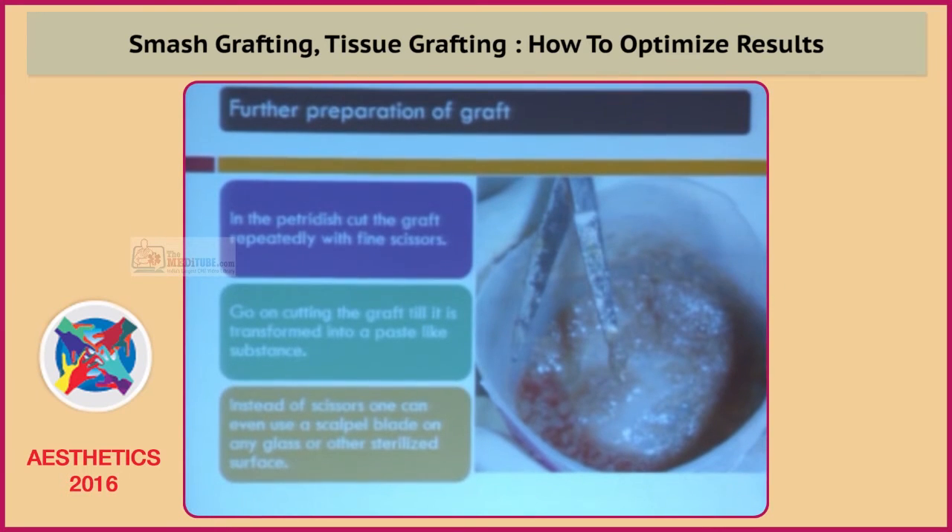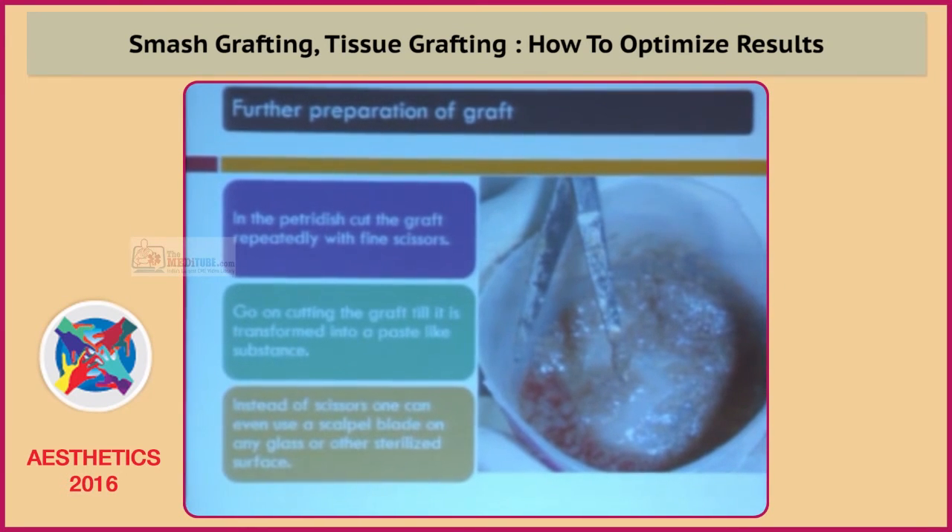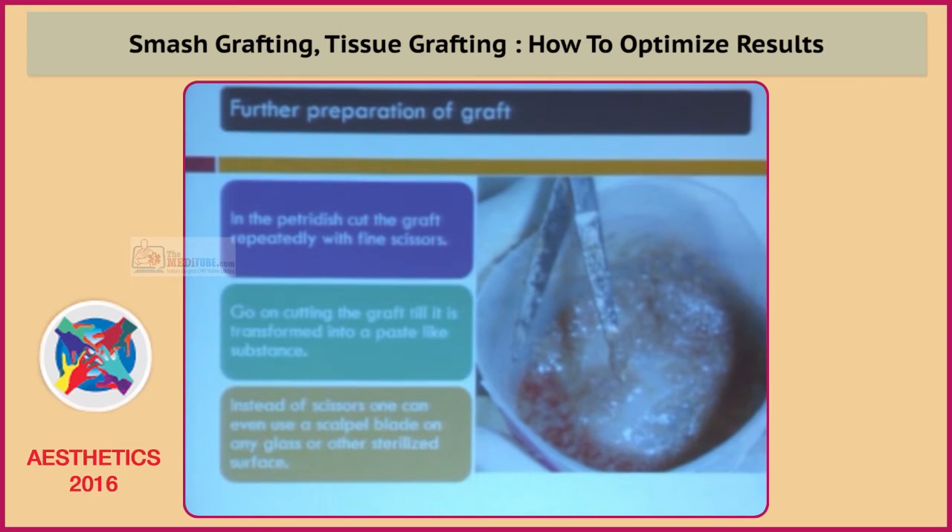We further prepare the graft by cutting it repeatedly with fine scissors. We continue cutting the graft until it is transformed into a paste-like substance, as shown on the right hand side.